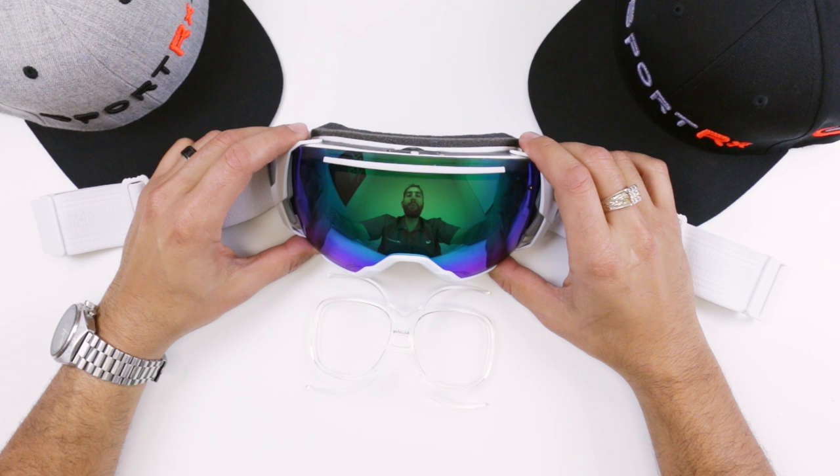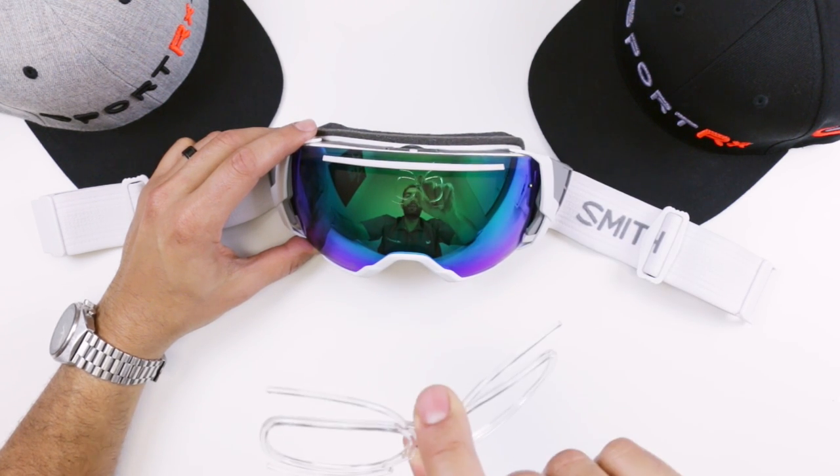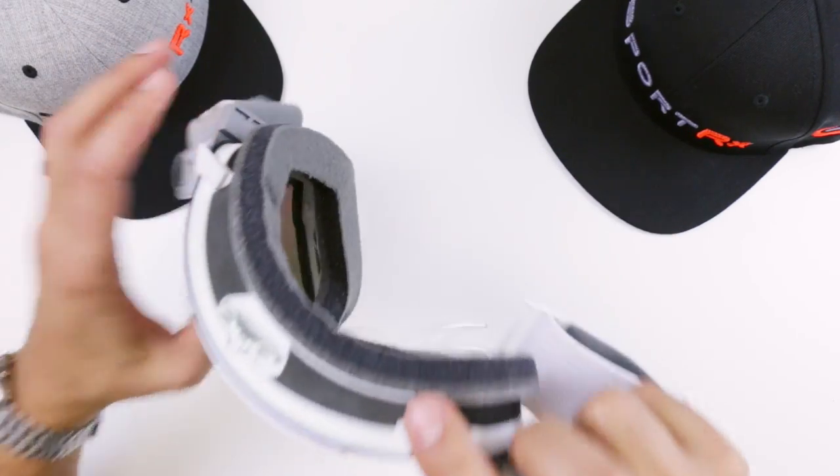Hey everyone, this is Sunglass Rob from SportRx and we're here to show you how to insert your prescription insert into your snow goggle.